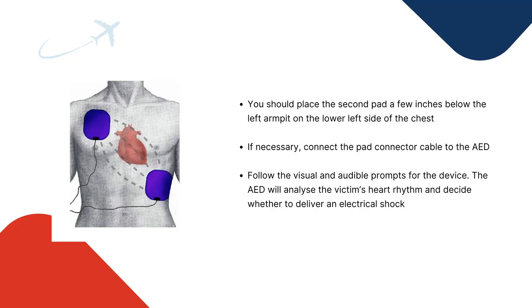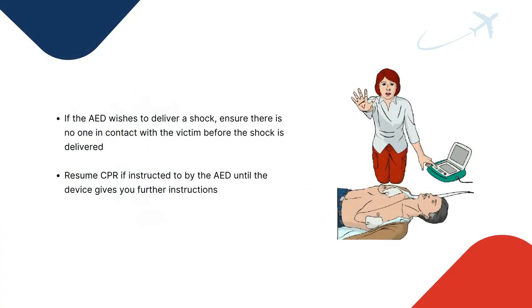Follow the visual and audible prompts for the device. The AED will analyze the victim's heart rhythm and decide whether to deliver an electrical shock. If the AED wishes to deliver a shock, ensure there is no one in contact with the victim before the shock is delivered. Resume CPR if instructed to by the AED until the device gives you further instructions.